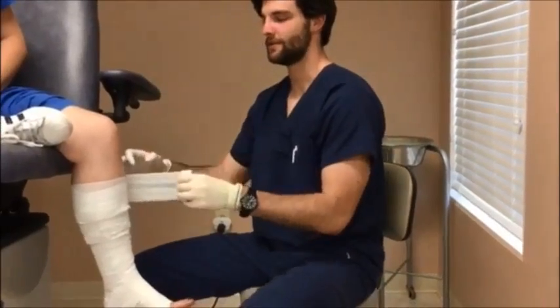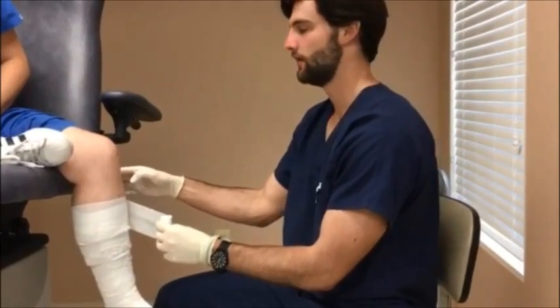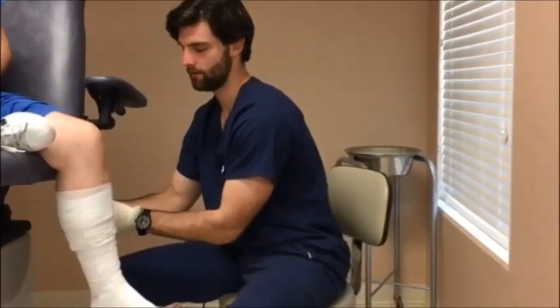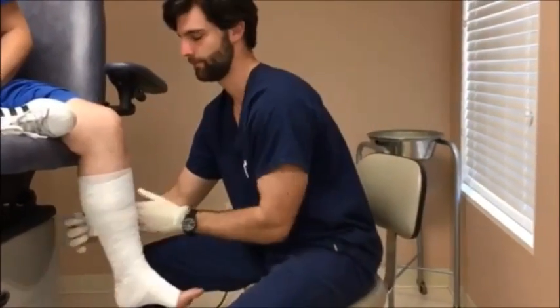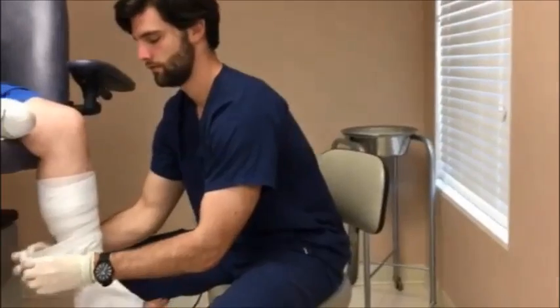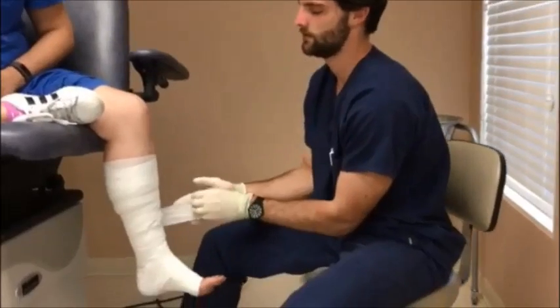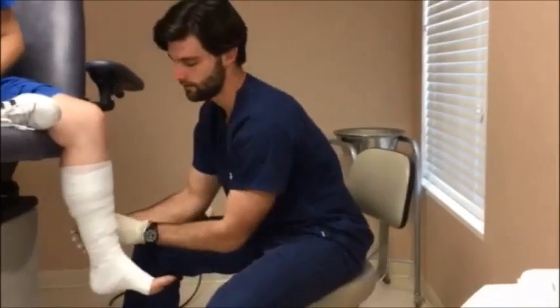So once you get to the top, just as any other cast, you want to make sure your 2 finger lengths beneath the top of the tibia head, and then you'll start wrapping it back down without overlapping, making sure it's not too tight, but still applying compression. And then you want to make sure you keep the patient's foot at 90 degrees. And then smooth the wrinkles out as you go along.